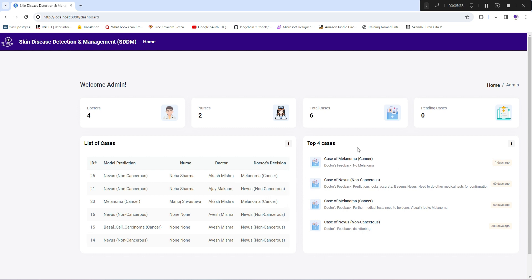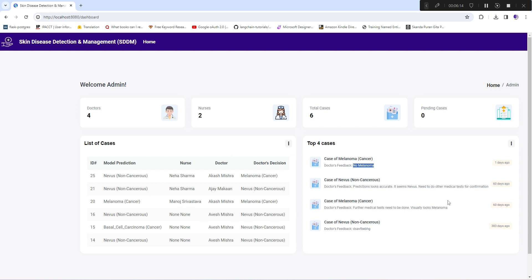The next section shows the top four most recent cases — for example, a melanoma case or a nevus case — along with the actual doctor's feedback. If feedback is empty, you can see how many days ago the case came in and follow up with the doctor to close the case. This is the overall view of the admin panel.